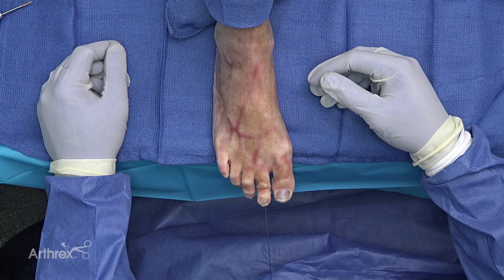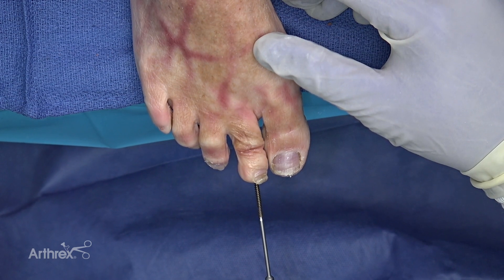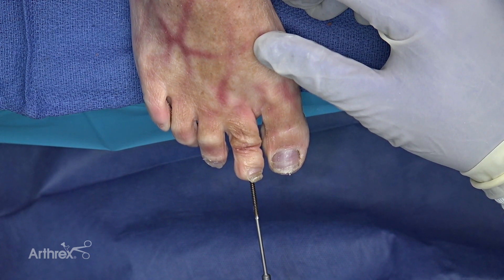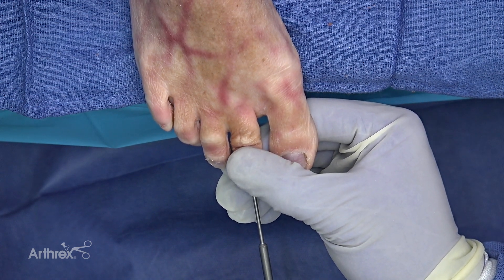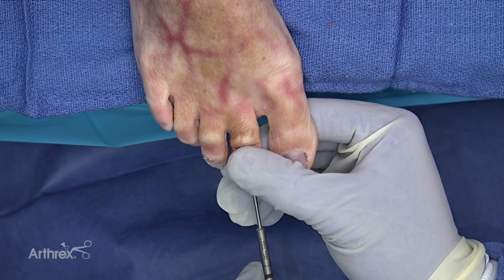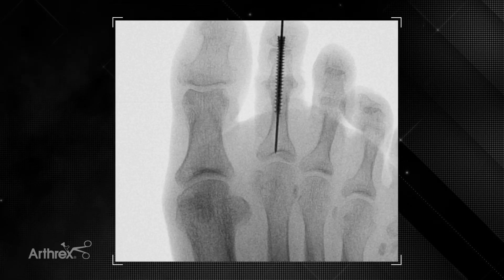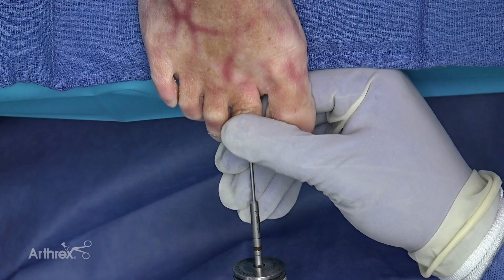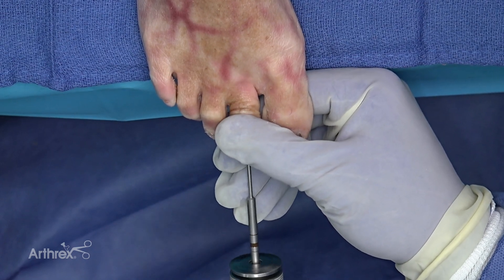I don't typically measure this screw — I almost always use a 26 millimeter 2.5 millimeter compression FT screw. If it's a really short toe I might go down to a 22. You can see when I insert the screw there's a tendency for the distal phalanx to rotate. It's important to correct that rotation during insertion of the screw, and I do that manually. I'll check the position on fluoroscopy and then finish by hand. When you start getting compression across the joint it's particularly important to hold rotation of the toe, because even though clinically it probably doesn't cause much problems, patients are very dissatisfied if their toe is mal-rotated.